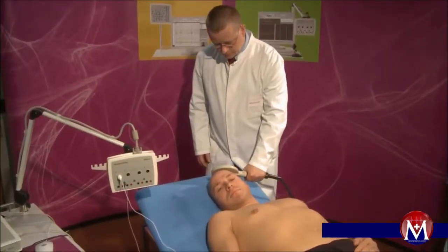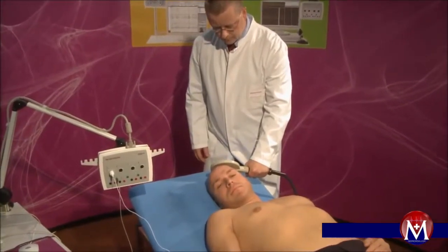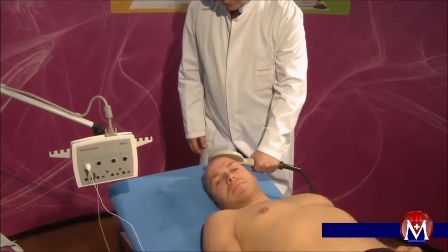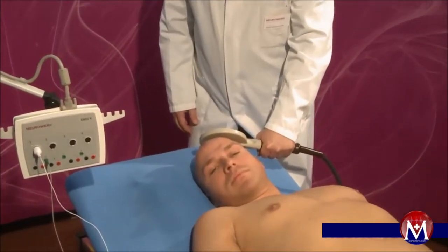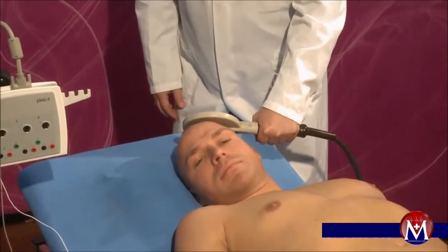The motor evoked potentials are shown here by using the example of the upper limb recording at the ulnar nerve. The measurement can take place while the patient is either sitting or lying down.